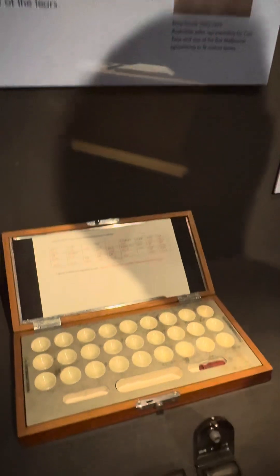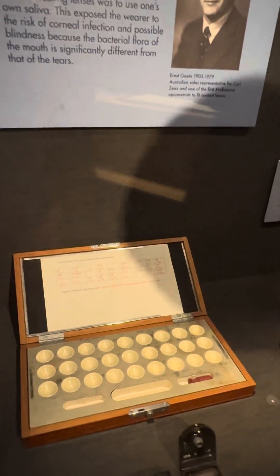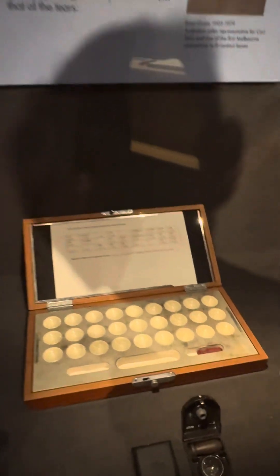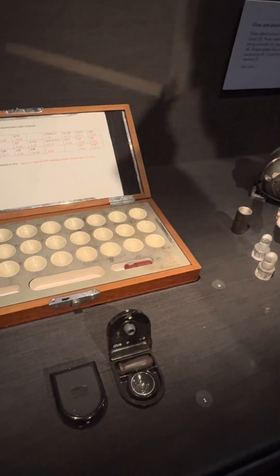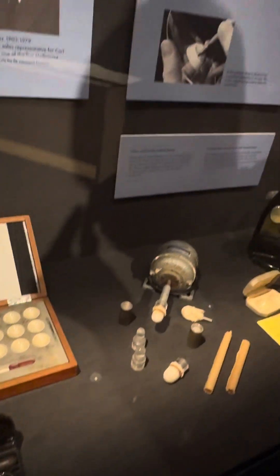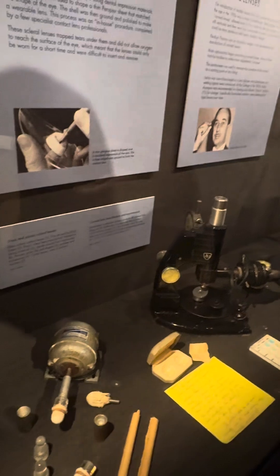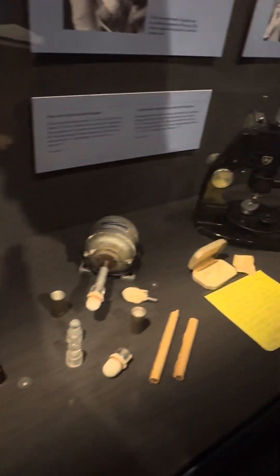These early lenses you'd only get a couple of hours wear before your eye went cloudy. This is actually a test set — they'd put one on you to find out what shape the white part of the eyeball was. The central area usually has a slightly sharper curve, so you'd use those test lenses to work out what shape you needed to make.